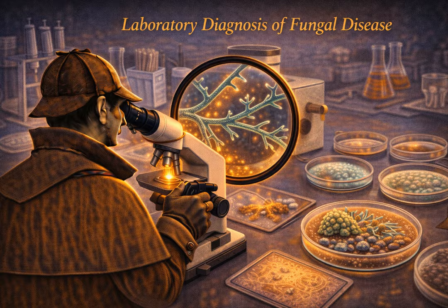Microscopic morphology. This is where we look at the fingerprint of the mold under the scope. For molds, the identification is almost entirely visual and structural. We look at 2 main things: the hyphae, the actual filaments, and the conidia, the spores and the structures that hold them. I want to compare the 2 big ones again because this is a constant battle in the differential diagnosis. Aspergillus versus the mucormycetes like Rhizopus. How do you tell them apart under the microscope?